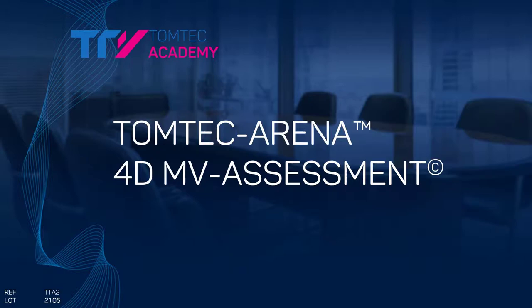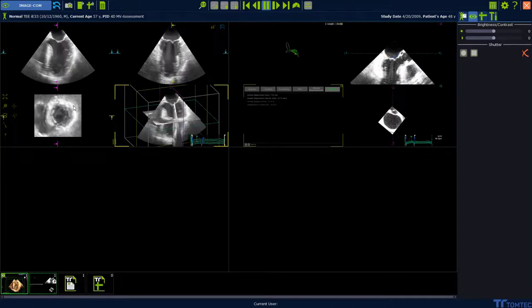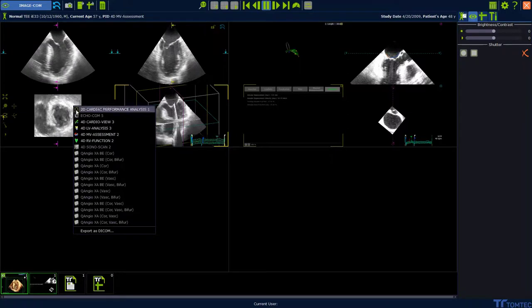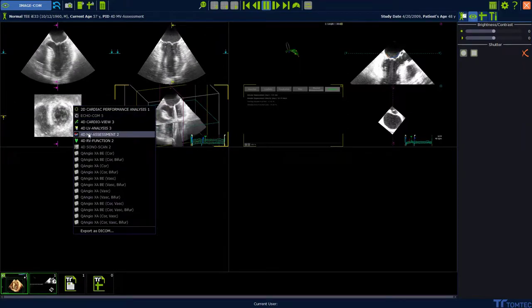How to use 4D-MV assessment. Start from Image.com. Select a 3D volume, press the right mouse button and select 4D-MV assessment.